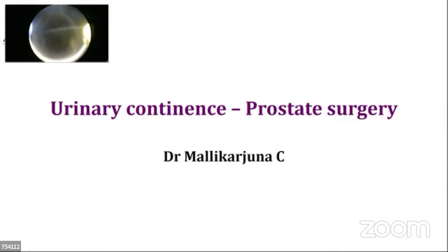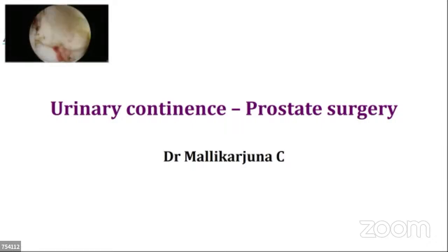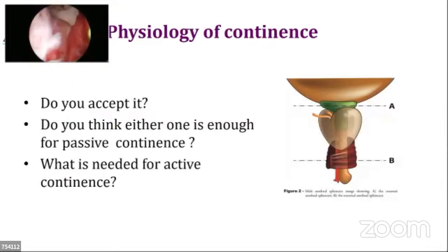Okay, then I'll be finishing this talk in the next 15 minutes maximum, and then we can look at what Taif has done at the end after dissecting the whole thing. So the talk is for the beginners or the learners of TURP, urinary incontinence and prostate surgery.